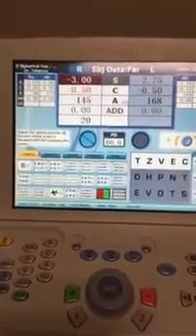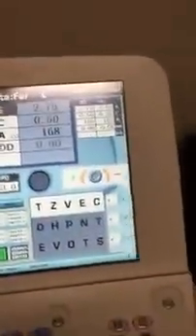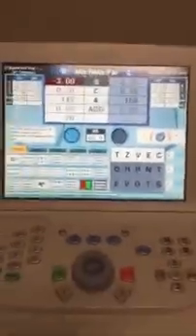If you wanted to change the line so it's not the TZVEC, simply go to your remote control for the M&S and press 20. And then you will notice, once I get this focused here, how it says TZVEC, if I press the 20 button, it'll change it to different letters if you think they're memorizing the letters and you want to change it up. If I change the letters on the M&S, it'll always say TZVEC on this system, so keep that in mind.